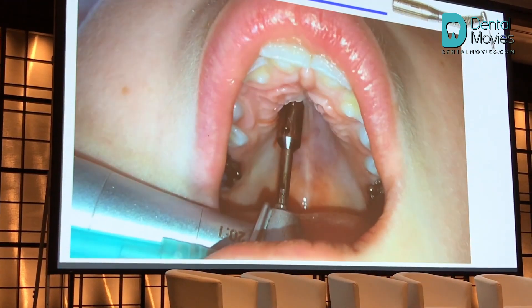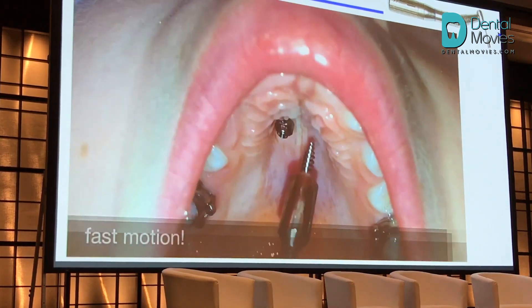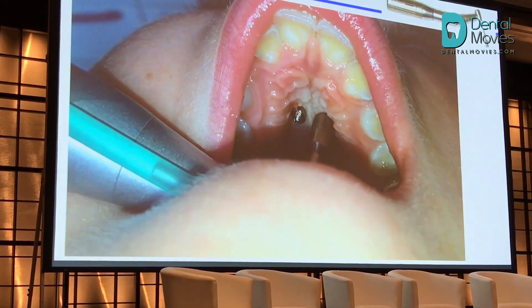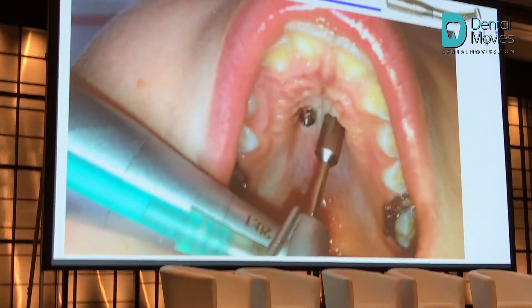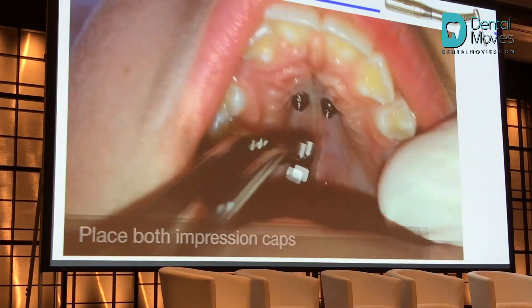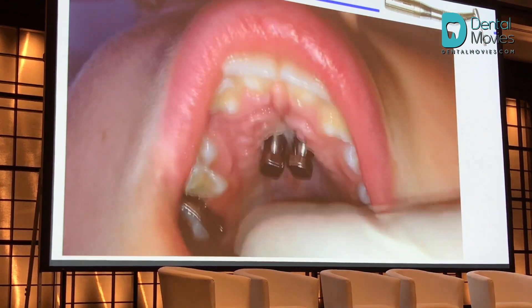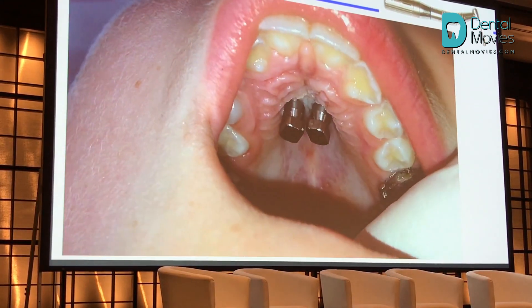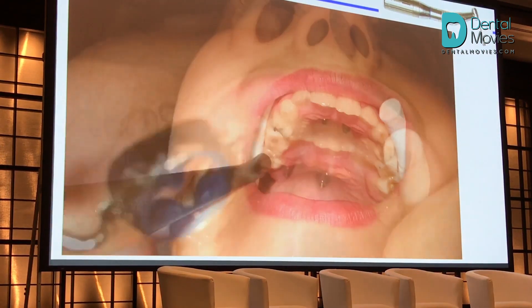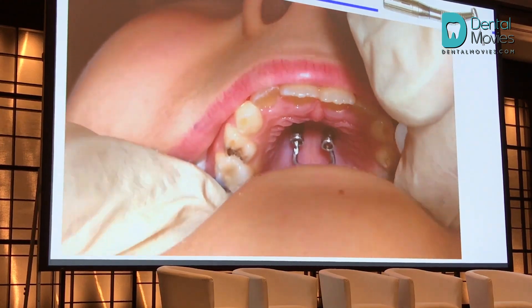You heard just in the speakers a very narrow palette, as you can see. So this was sort of a fast replay. Here we see the impression caps, both in place. The bands fitted the molar. And here is how the appliance is fitted in the mouth.